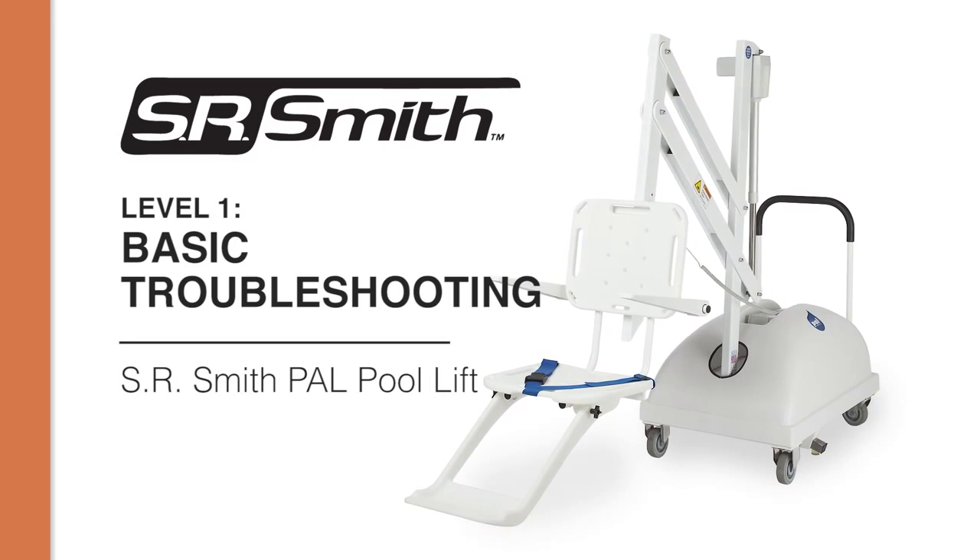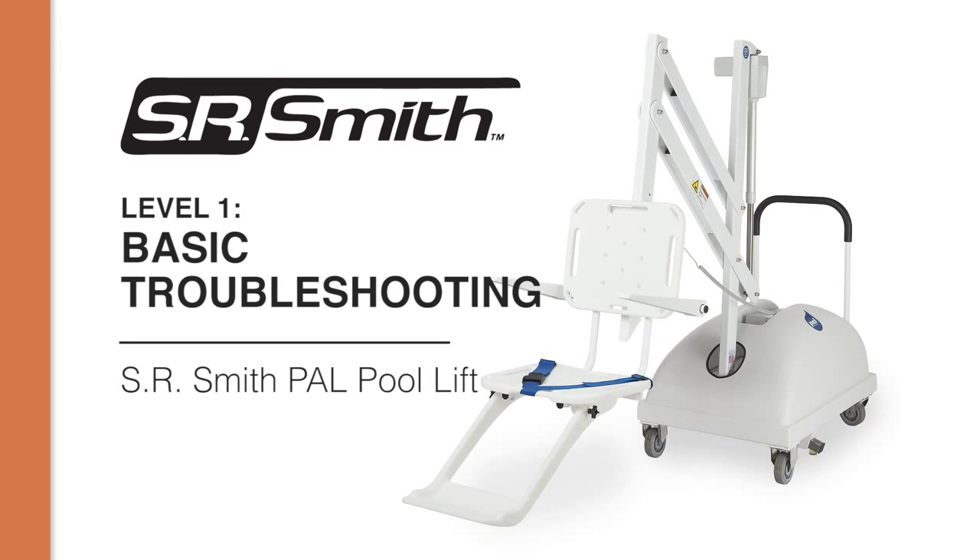In this video we will demonstrate how to perform basic troubleshooting methods for your SR Smith pool lift.